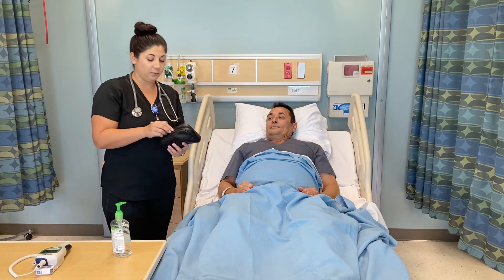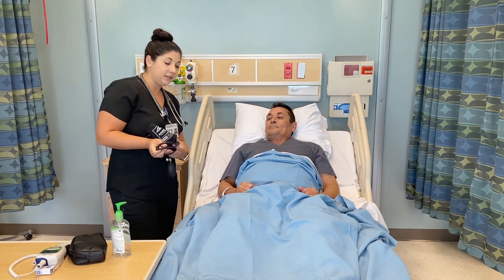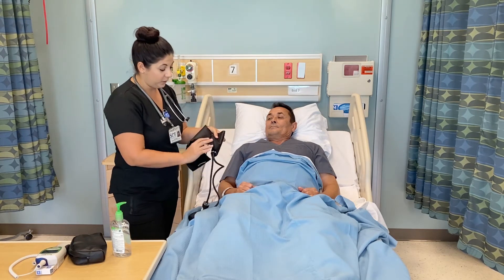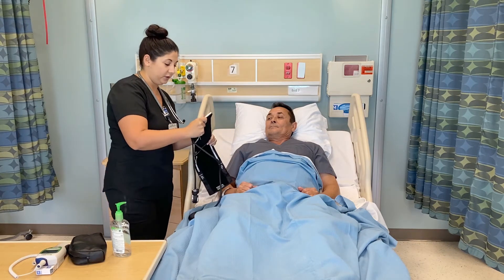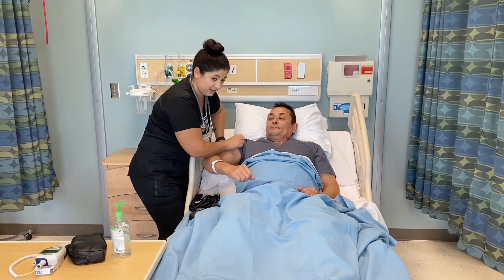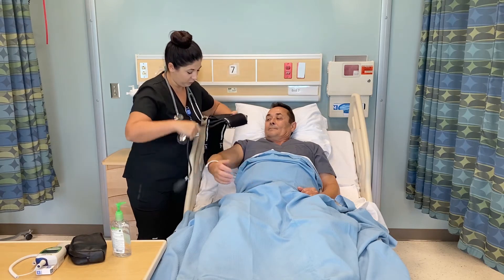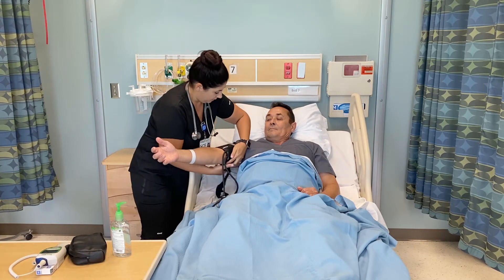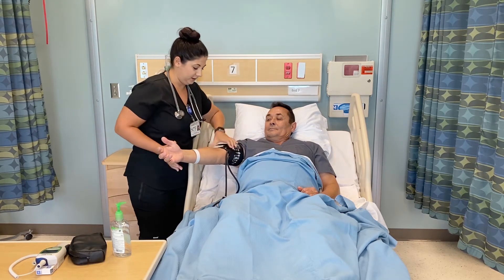Next I will check his blood pressure. I'm going to ask if there's any reason we can't use either arm — does he have any IV sites that would be in the way? Has he had any surgeries that would preclude us from using it? For women or men who've had a mastectomy with node removal, we want to avoid that site. Think about which side would be appropriate for your patient. You want to roll up the sleeve — it's best not to have any fabric underneath the site. Line up the artery marker on the inside of the AC, make sure it fits snugly, at least two centimeters above the AC area.